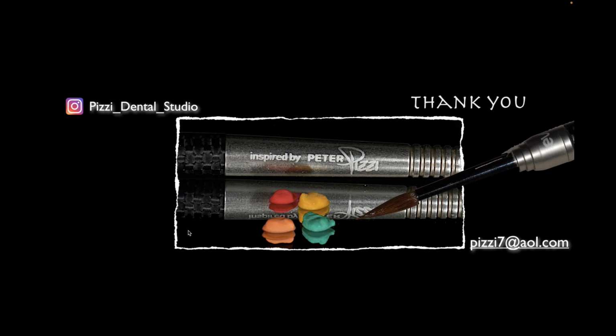Yeah, so we switched to, I think it's the Schutz material now. It's coming from Germany. I know they're trying to distribute it here in the States, and I think they've established a place to distribute it here. So if you want, email me and I'll give you some.